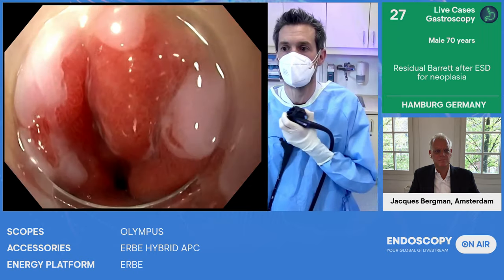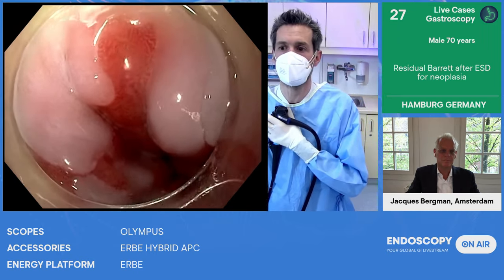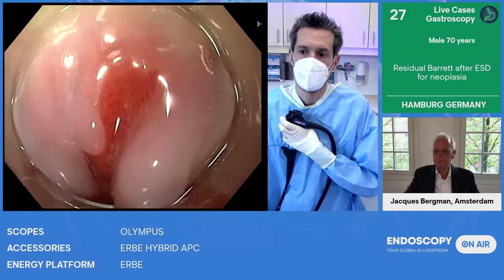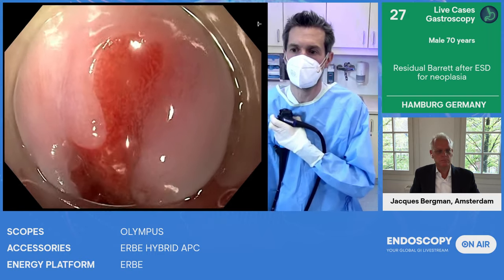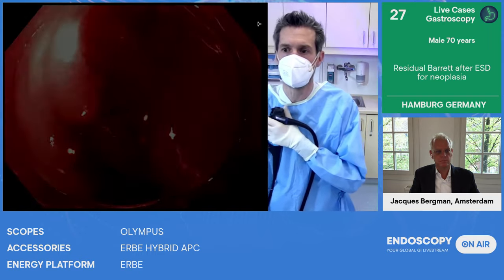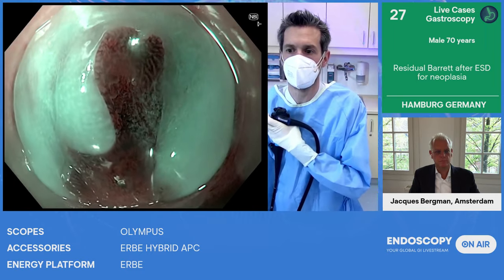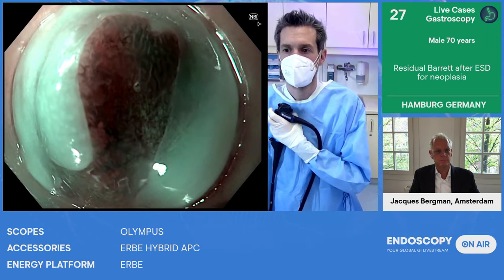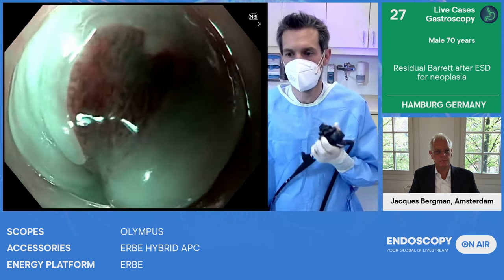And we want to have a look here. As you can see, we have a transparent hood to keep some distance to the mucosa and to have a more stable position to get a clear and close look to the surface. To enhance the vascular pattern, we can use NBI. As you can see on the top right, I have the near focus used as well. So this is one of the small areas that were described.